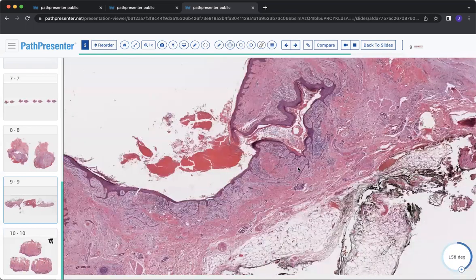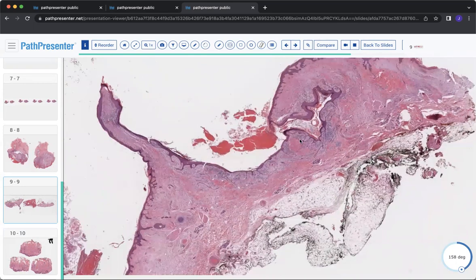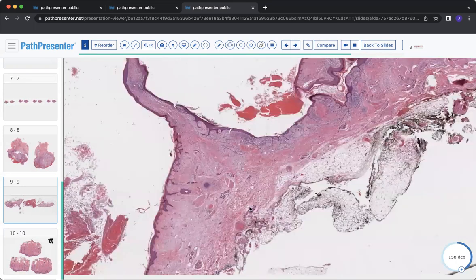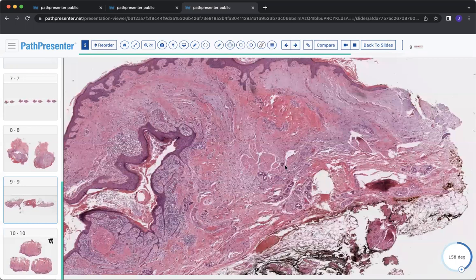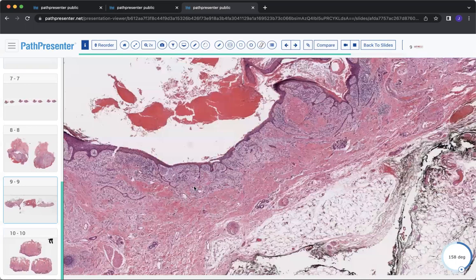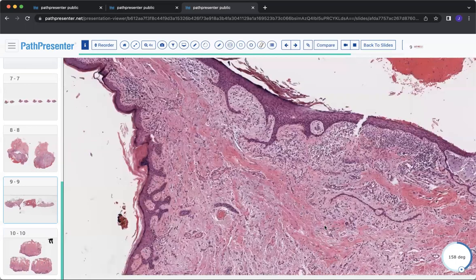Sometimes people say that it looks like a mitt-like structure. So you can kind of imagine this could be like a baseball mitt ready to catch the ball. It's interesting. I don't understand why, but when they're processed, they can sometimes look this way. I wouldn't rely on that 100%, but just to give you that disclosure that it seems like that's one of those buzz phrases that people want you to remember about this entity, and that has been taught over the years.